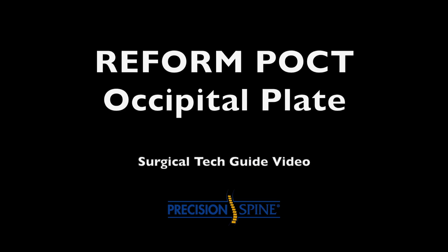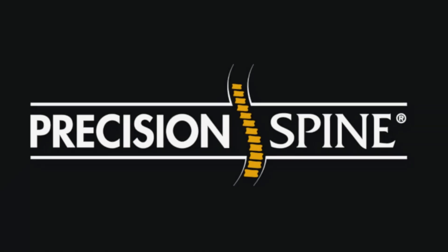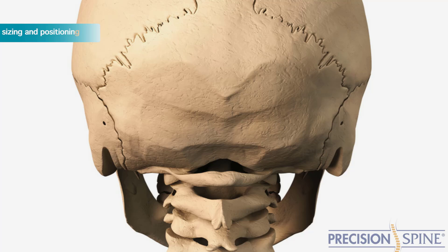REFORM POCT Occipital Plate Surgical Technique Guide Video. Step 1: Occipital Plate Size Selection and Positioning.